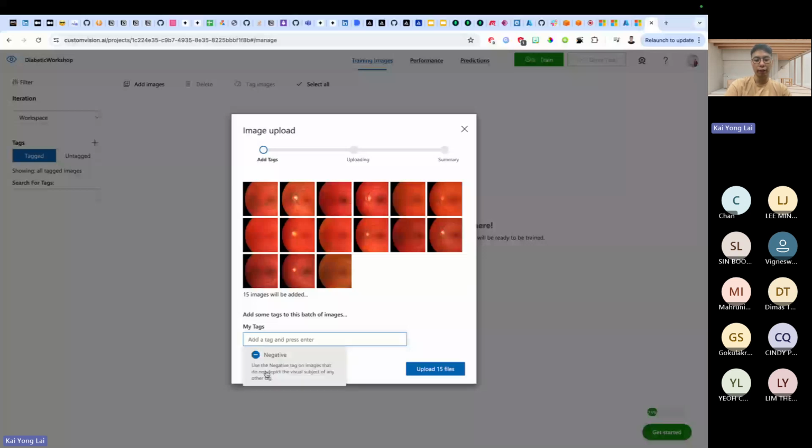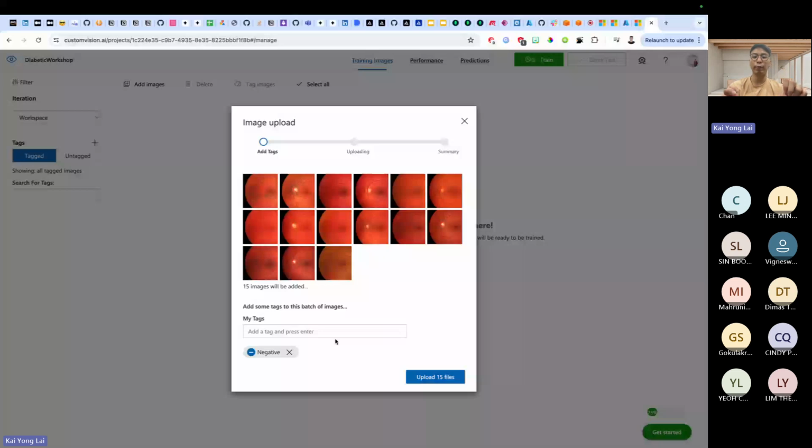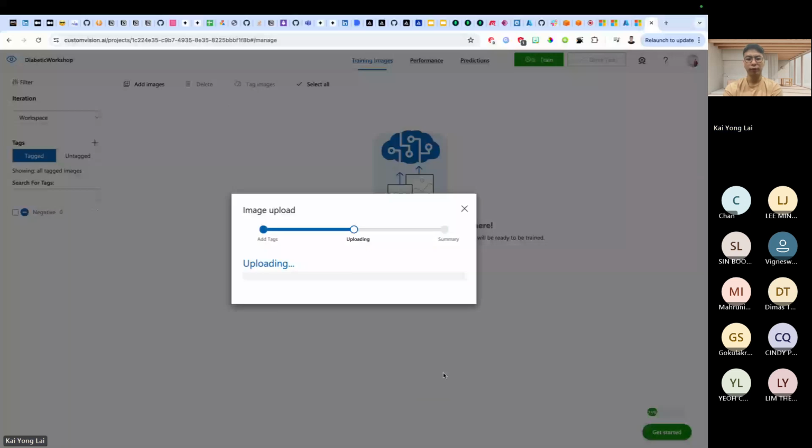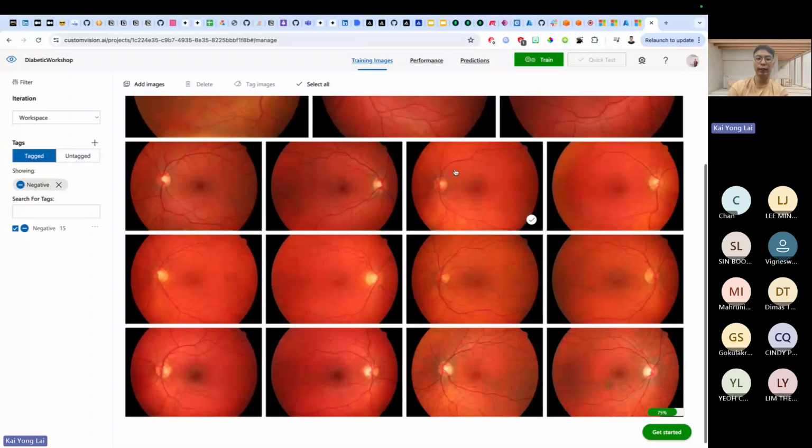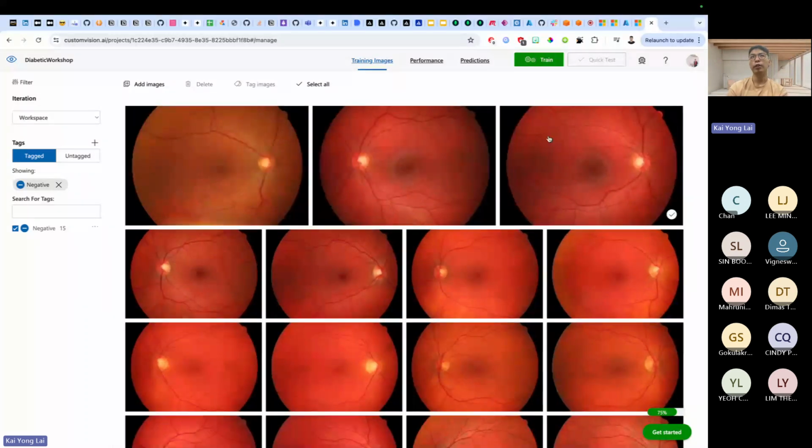But I think we can go with a negative tag, because in a medical context, positive means that you have the disease and negative means that you don't have it, right? So this is a normal one. Just type in negative. If the pop-up doesn't appear for you, that's fine, but if it does, just click on negative, all right? So upload the 15 files. It will take a few seconds to upload. So now we have all of the healthy data for training our models, okay?